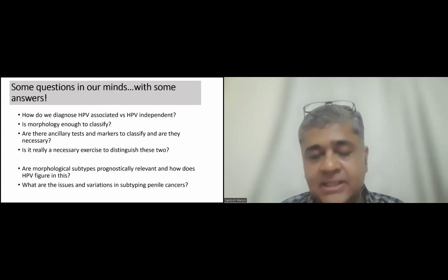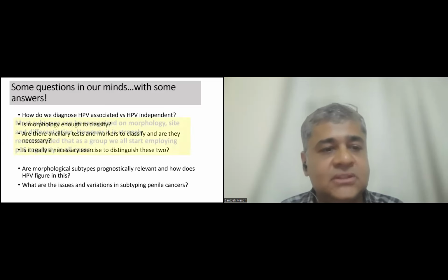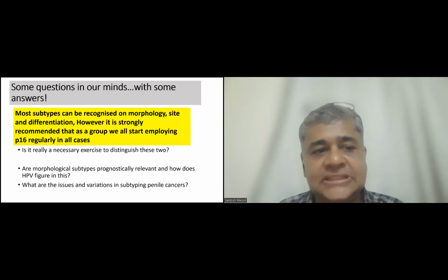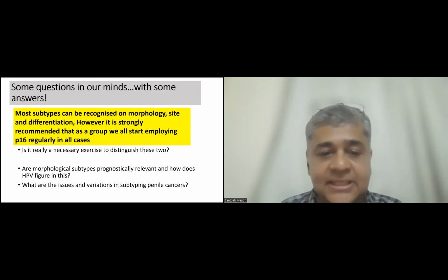So we come back to the last slide. These were the questions we asked ourselves at the beginning of this lecture. I'll say most of the subtypes can be recognized by morphology, site and differentiation. However, it is strongly recommended that as a group, we all start employing P16 regularly on all cases. The question is, is it really a necessary exercise?